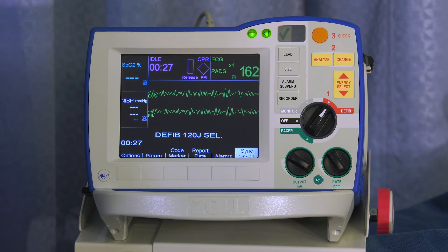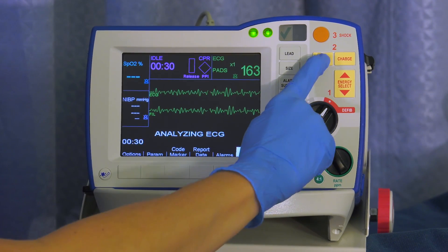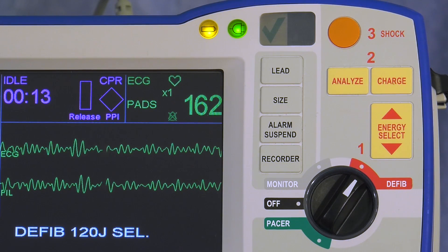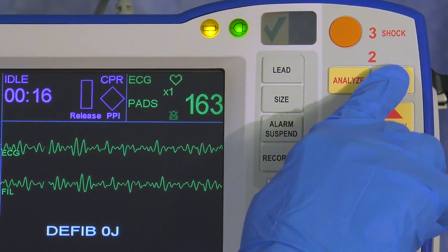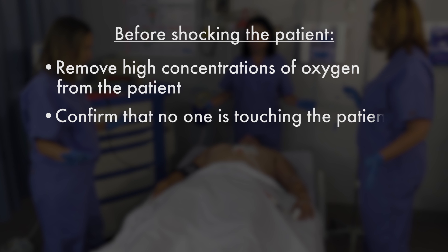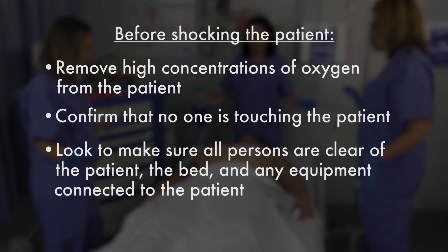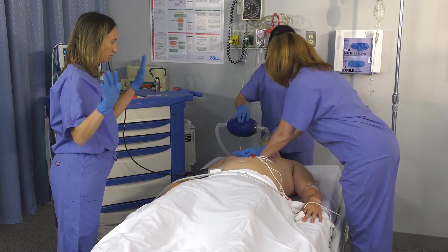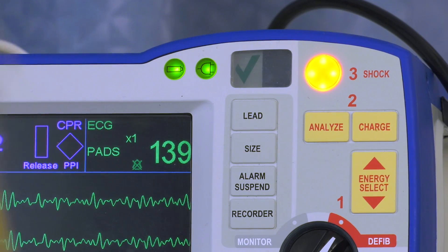Step 2: BLS providers press analyze and follow screen and voice prompts, then step clear. ALS providers press charge. Before shocking the patient, ensure the environment is safe for defibrillation. Remove high concentrations of oxygen from the patient. Confirm that no one is touching the patient. Look to make sure all persons are clear of the patient, the bed, and any equipment connected to the patient. Loudly warn all persons to stand clear. Step 3: Press the illuminated shock button.